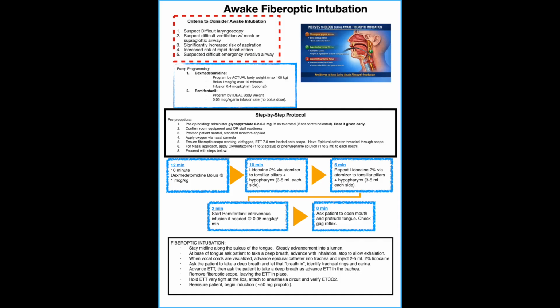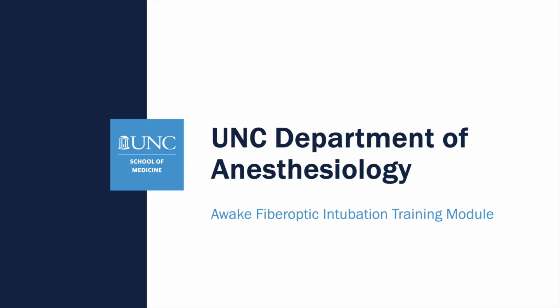Awake fiberoptic intubation is one of the most important skills in difficult airway management. By recognizing when awake intubation is indicated, understanding the airway anatomy and innervation, applying evidence-based topicalization and sedation strategies, and following a standardized protocol, residents can significantly improve both safety and success. Mastery of this technique will not only help you care for your complex patients, but will also prepare you for ABA OSCE and oral board scenarios.